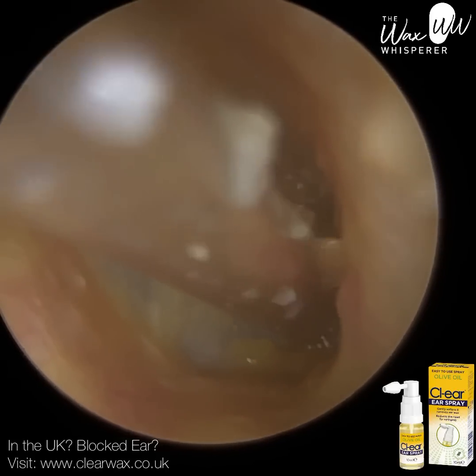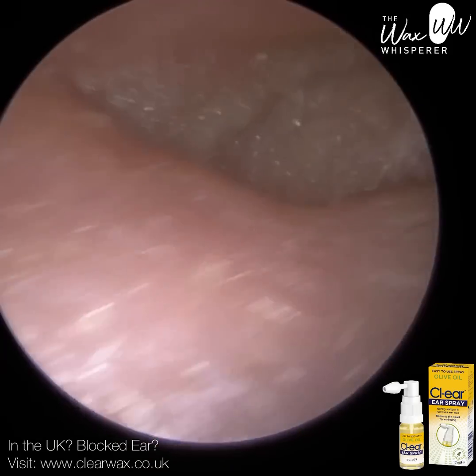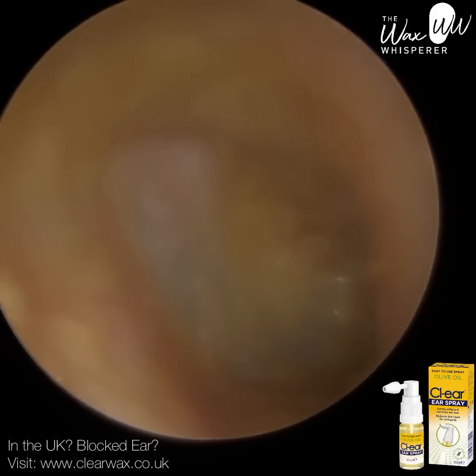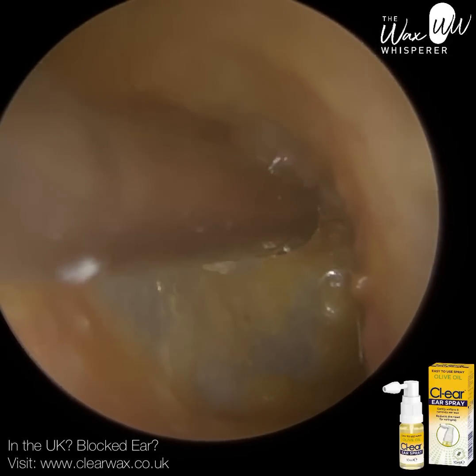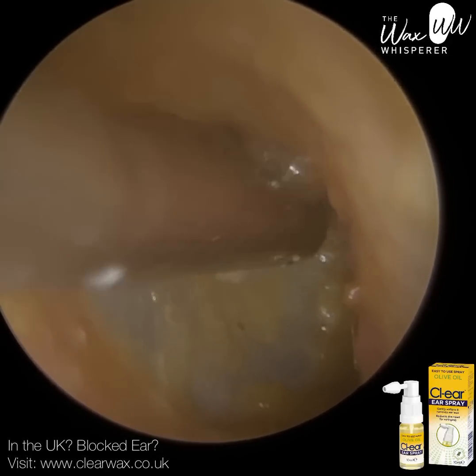Prior to attending, I recommended the patient just to use the drops for a couple of days, just to help soften it. And I've cleared the main blockage. You can see probably two-thirds of the eardrum. It's just the superior aspect — north of the eardrum, and also the east, even where we are now. So this is the anterior recess.